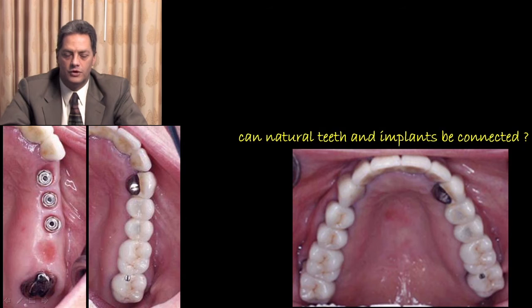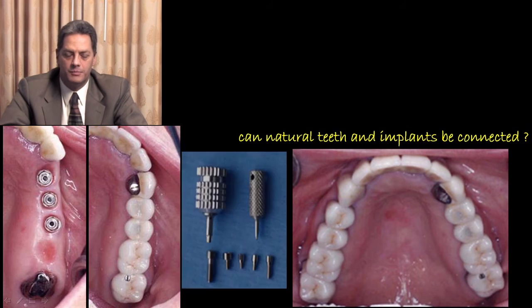This is the final view on the upper arch. And the type of screws that we utilize, you can see the dimensions as we have a screwdriver with the size of a screw that goes into the implant, a gold screw that's much smaller going onto an abutment, and here we have the mini screws that can be tapped and utilized on the prosthesis going onto the coping. We can have a mini screw that is 1.0 in diameter or 1.2 if there was any stripping, and we have a short one as well as a long one.